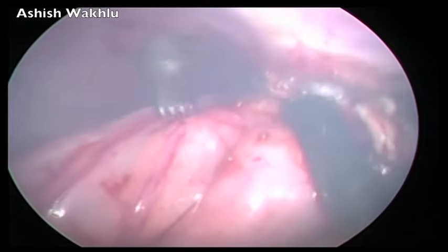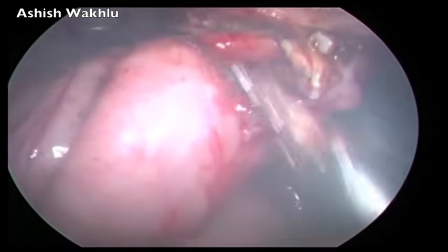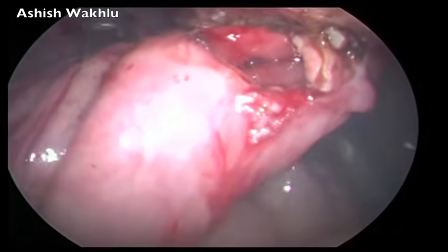So this is the colostomy in the process of getting dismantled from the abdominal wall, from the peritoneal aspect.